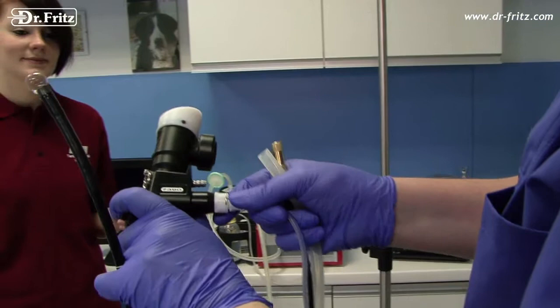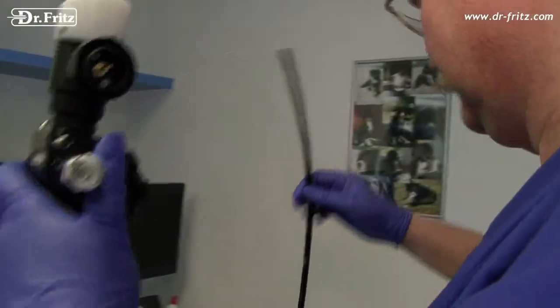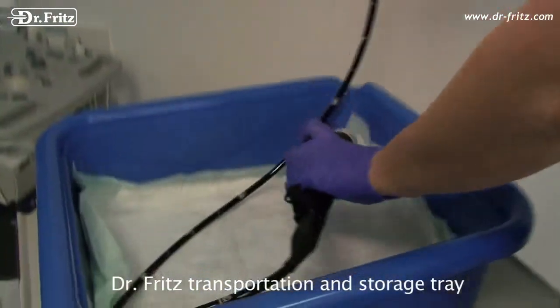The new transportation and storage tray helps prepare the scope before surgery, and afterwards it guarantees safe transport back to the cleaning facility.